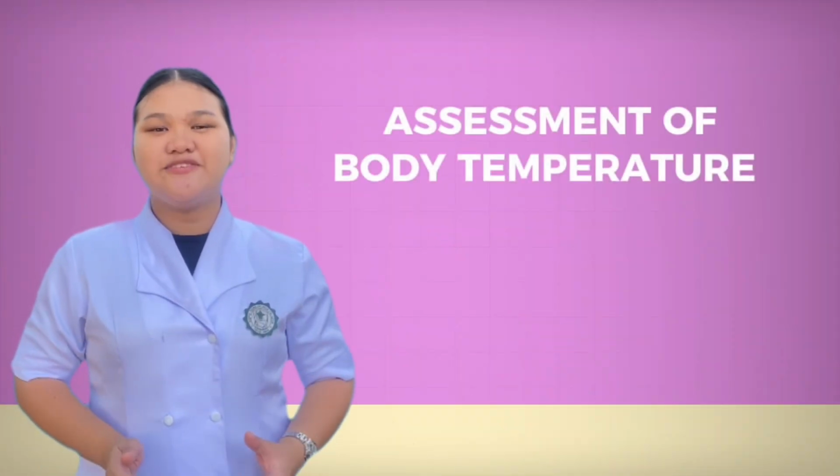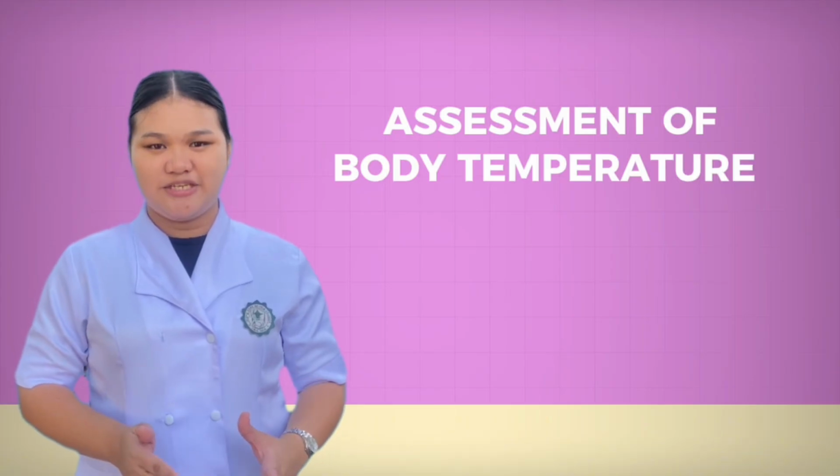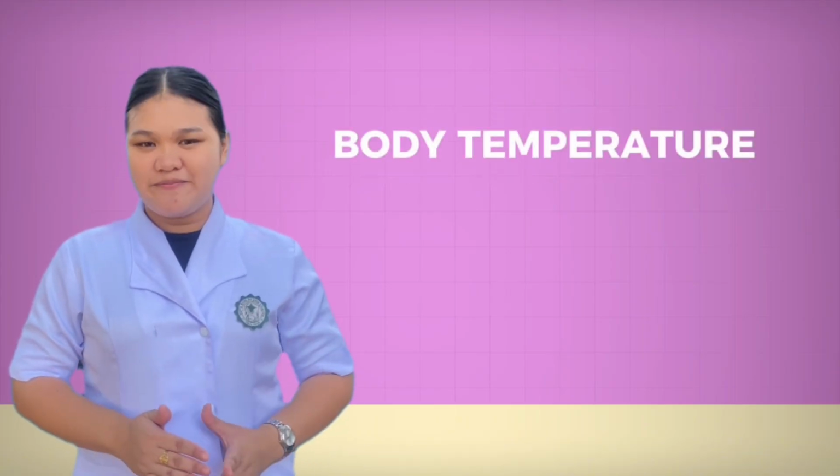For the first demonstration, we will show you the proper assessment of the body temperature, including the correct use of the thermometer and to ensure an accurate reading. For the first part of our video, I am going to explain the assessment of the body temperature. So what is body temperature?